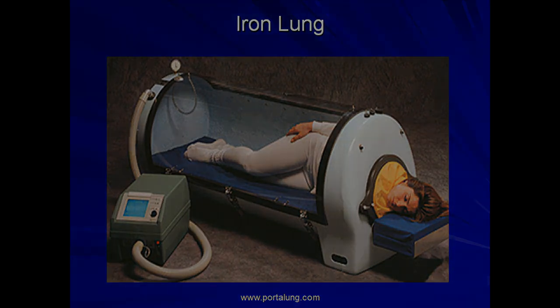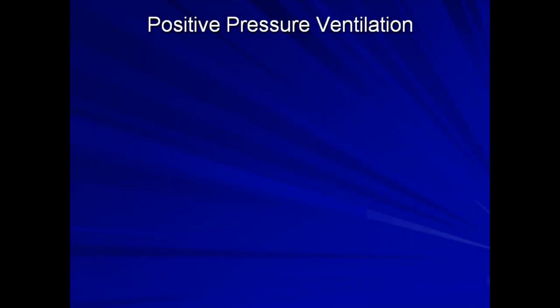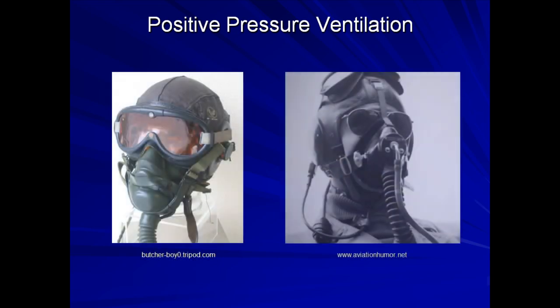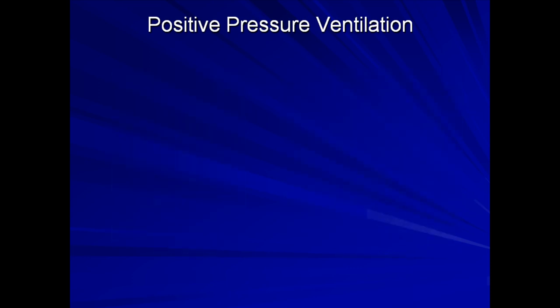Let's now look at positive pressure ventilation. The first serious research on positive pressure ventilation didn't occur in the hospital, but rather in a research lab where the military was investigating better ways to deliver oxygen to high-altitude pilots during the 1940s. Positive pressure ventilators didn't enter the medical setting until the 1960s, and were still quite rare until the 1970s, which I still find amazing considering how ubiquitous these life-saving devices are just a generation later.